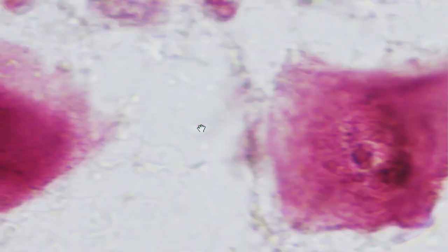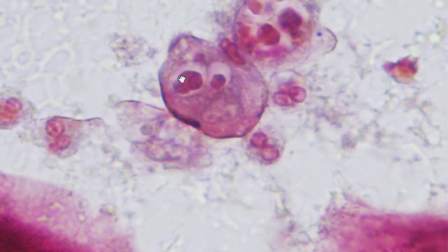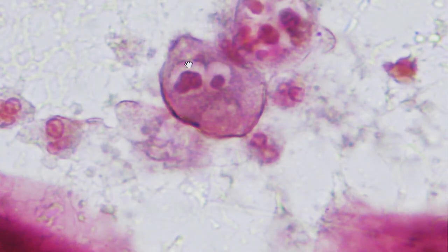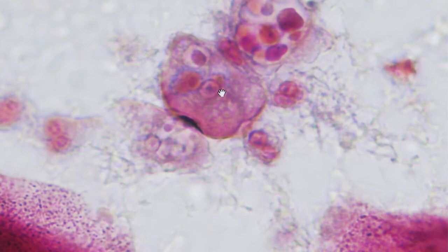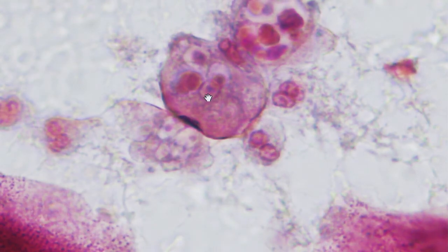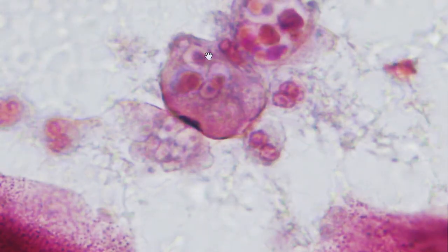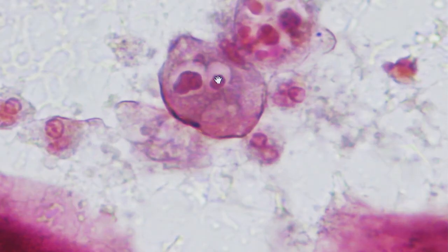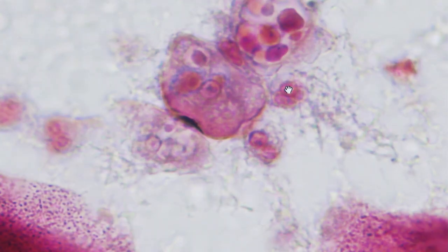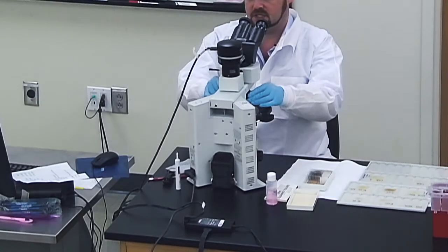Let's have a look at just one more before we go. This is a lovely one because it has eaten a white cell. So this is a white cell which it has ingested. There's your nucleus, eccentric karyosome, slightly uneven peripheral chromatin. You can see it's heavier there than it is there. And all these ingested bits, here's your pseudopodia and an ingested white cell. So that is Entamoeba gingivalis, and that's the end of the webinar on the morphology of Entamoeba in humans.